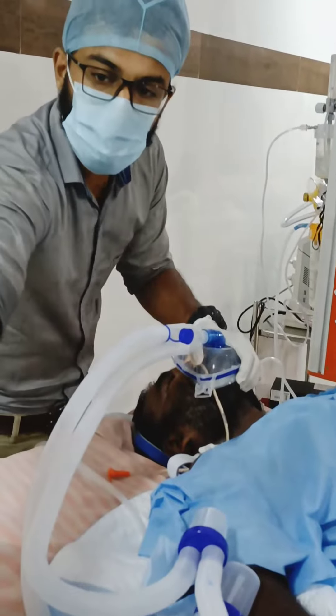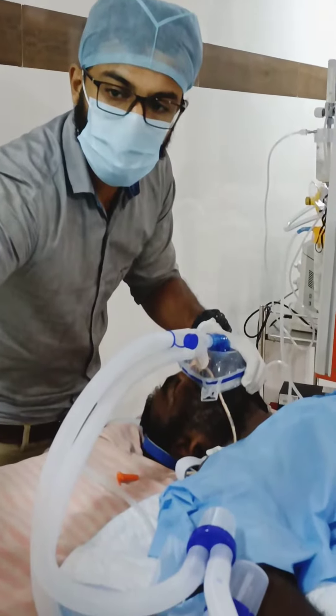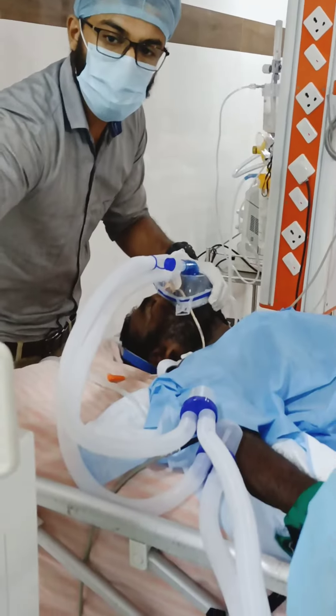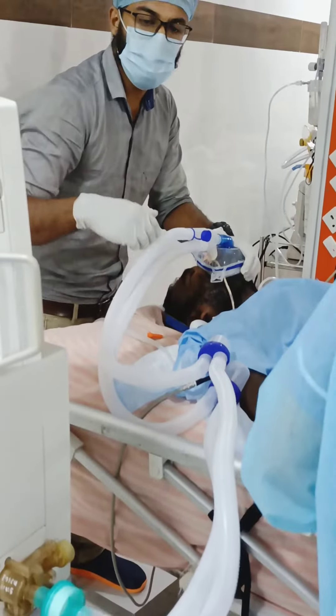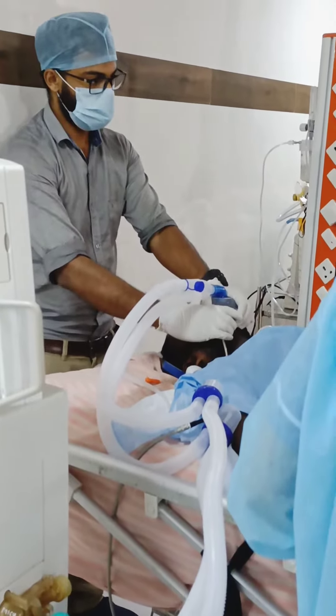This is a demonstration of an intubation. Here we have a patient, a 55-year-old male with difficulty in breathing.